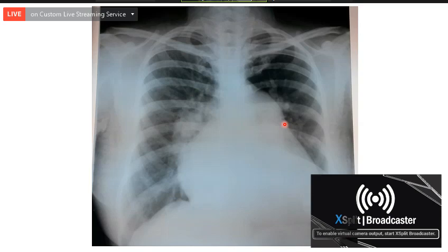TAPVC, post-stenotic dilatation, and sometimes idiopathic dilatation of the pulmonary artery. So in this patient, we are finding that the patient has a prominent pulmonary segment. So we have to decide what may be the cause. Is it a pressure overload? Is it a volume overload? Or is it a combination? It can be a combination.